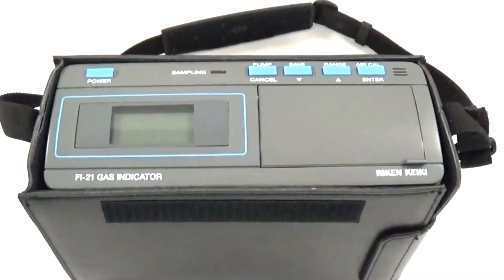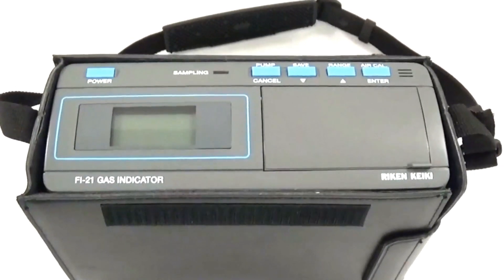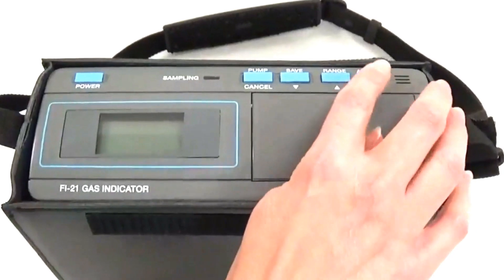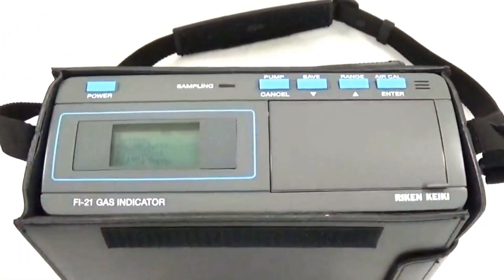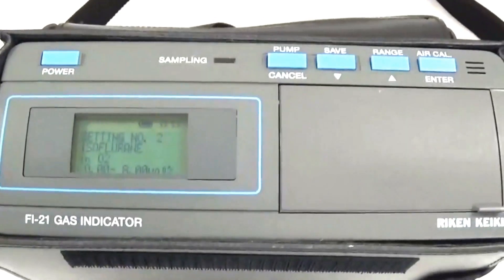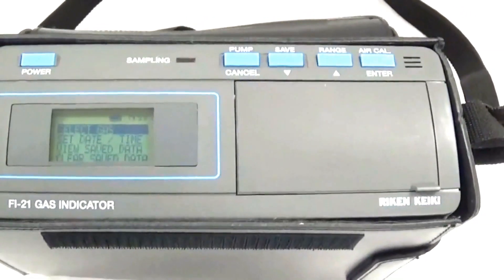We are now ready to turn on the Riken Fi21 gas analyzer. In order to do this, we will press down on the Air Cal Enter button while pressing the Power button. Notice the unit will beep and it will go through a couple of screens to verify that everything is working properly.